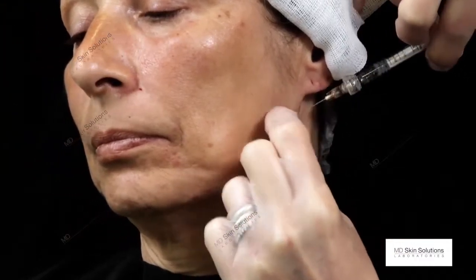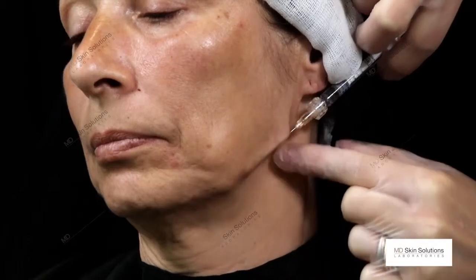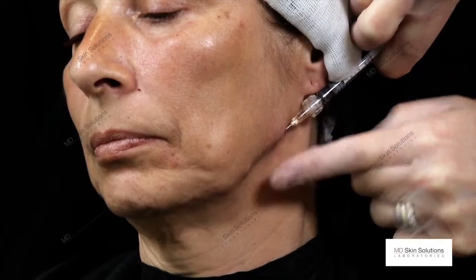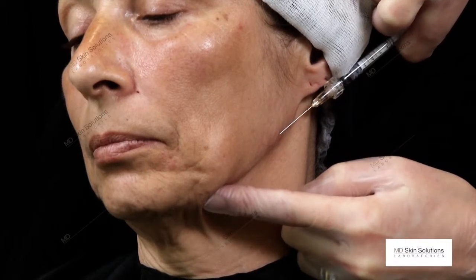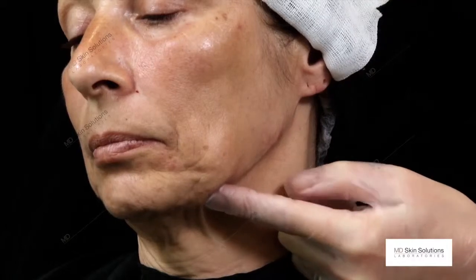Second pass again. Objective is to redefine the jawline here. Stretch the skin and see how the filler works in perfectly.